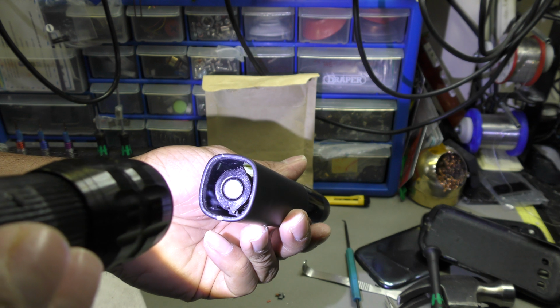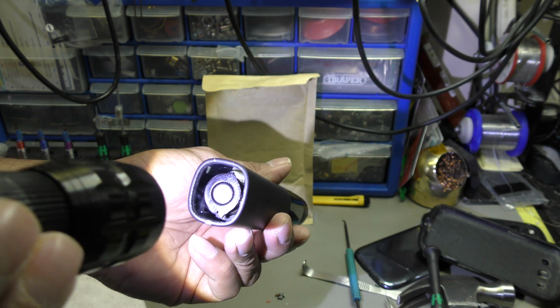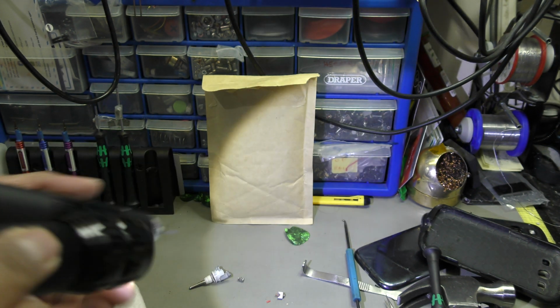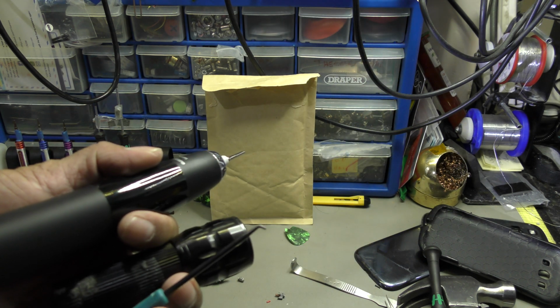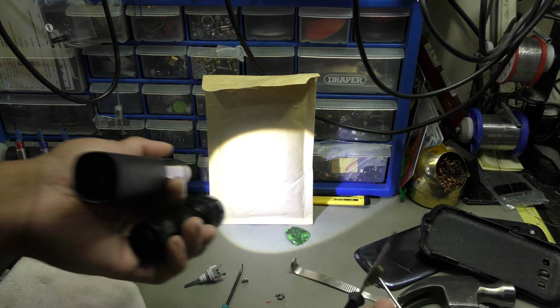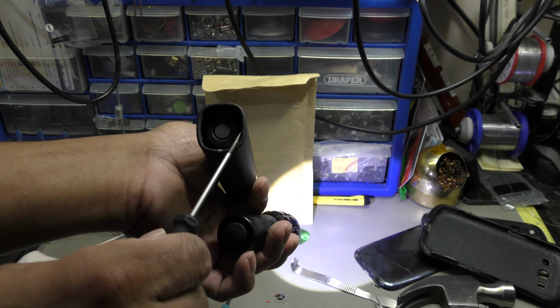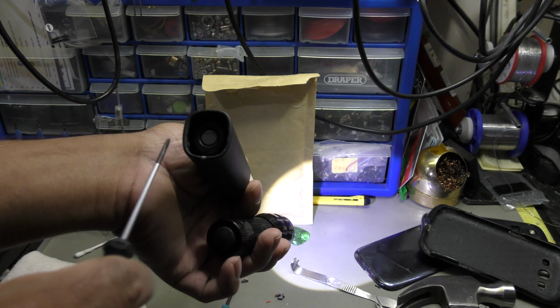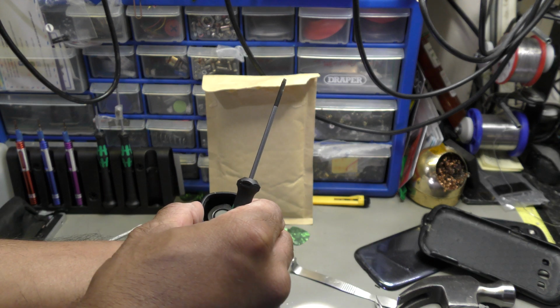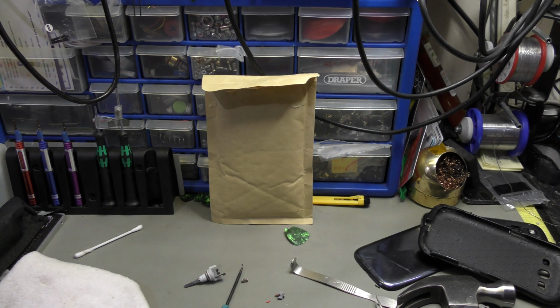Okay, so hopefully you can see that those clips have gone back in their place in the housing as I've nice and gently pressed on it, and there we go. You can use a little tool like this. I've used a thin flat-tip screwdriver and pried one end out nice and gently, don't break it, and then the other end while applying a bit of pressure on the tip so it pops out a little bit, and that's as easy as that basically.